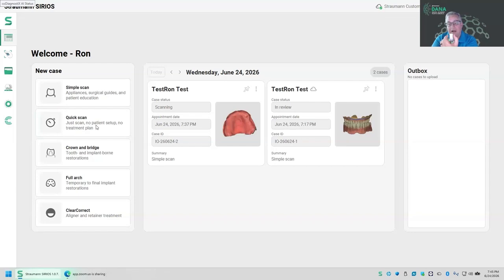This one has a narrower head than average, which should help. We also did just increase the depth of field. It's now 18 millimeters. So you should only need to get the scanning window 18 millimeters from the roof of the mouth, and it should be narrow enough to get in that position. I've not done it firsthand, so I can't tell you for sure that it does or doesn't do it well.